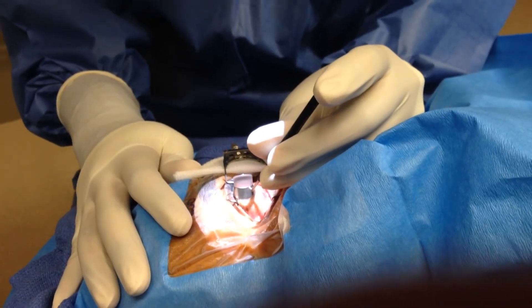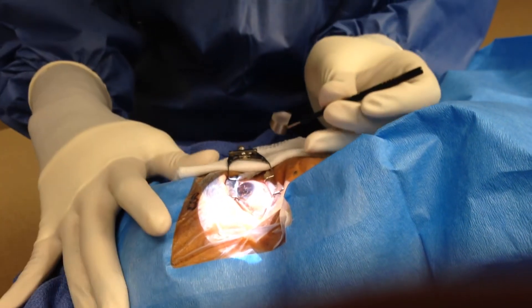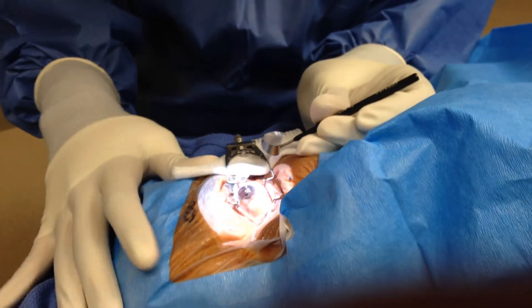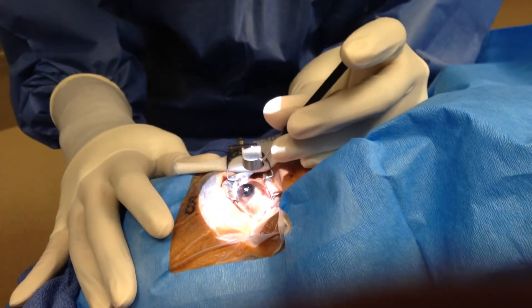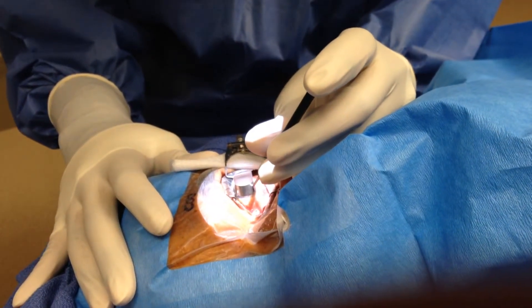If you find that your gonioscopic view is inadequate, it may be due to poor head rotation. Feel free to rotate the head more in order to get the proper view.